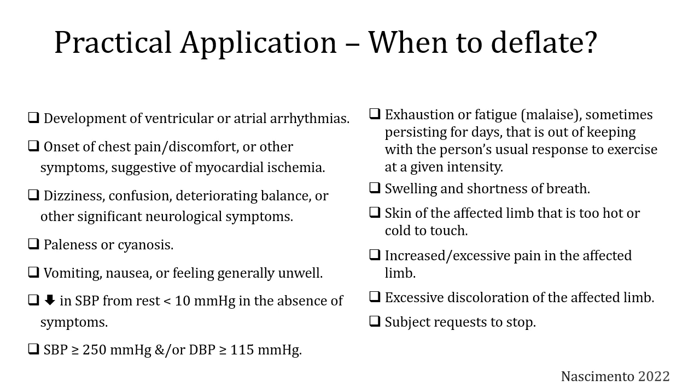And the fact that I'm suggesting these as time points or indications to deflate does not suggest that this is what you would otherwise expect, or that BFR increases the risk of these things happening, but they could potentially lead to further adverse events, and so you're consistently monitoring your patients regardless of the modality that you're doing, BFR or high intensity resistance training, or really any form of intervention.